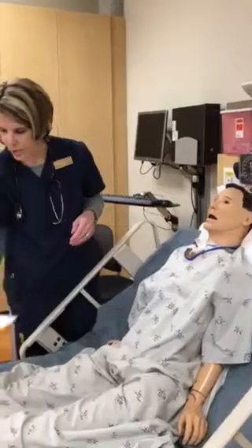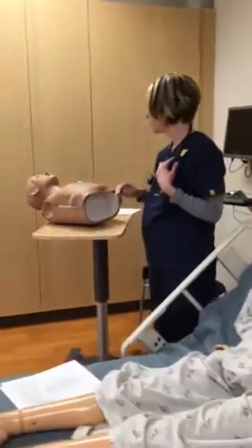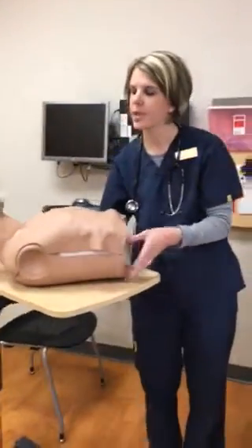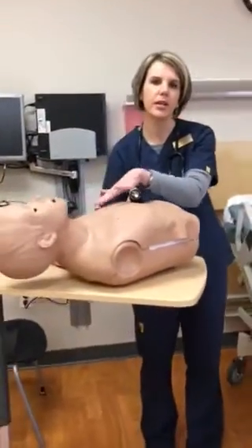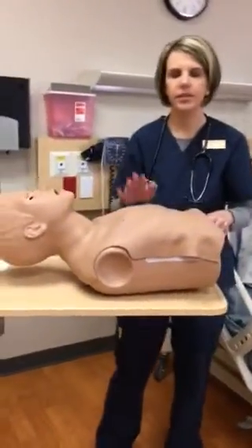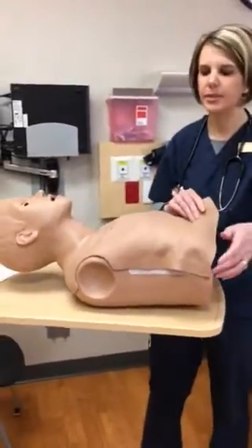Next we're going to go ahead and listen, and I want you to listen to the 4 valve spots that we talked about in class: the aortic, the pulmonic, tricuspid, and mitral. I'm going to go ahead and just demo on this guy because you can see the intercostal spaces better.